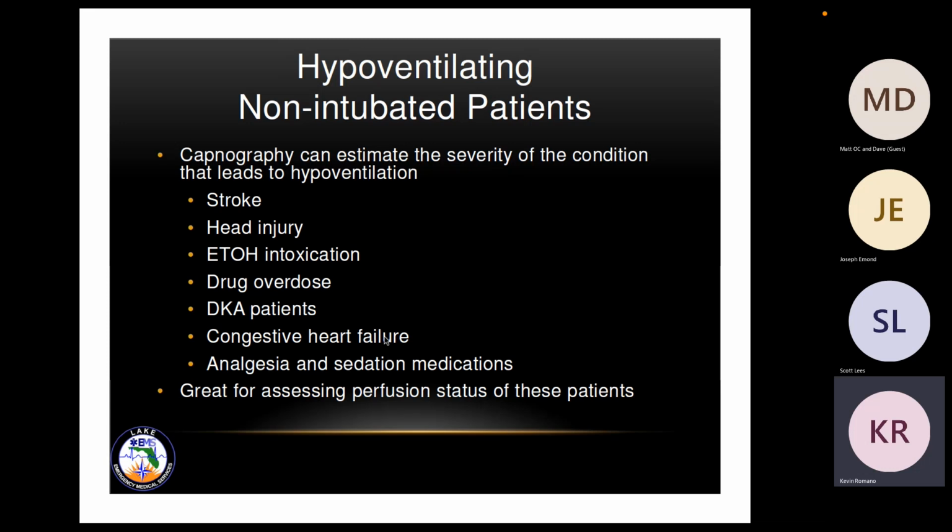With that being said, this would be very helpful in a delayed sequence induction where we're giving ketamine prior to maybe intubate, 3 to 5 minutes after, versus doing etomidate and succ, which is a more rapid sequence induction versus your delayed, where we start looking at ketamine and roc. So with that being said, utilize the tools that we have for what we're doing. Now, if the patient is being intubated anyways, they probably should already be on end-tidal, at least nasal cannula either way. So it's already going to be there.